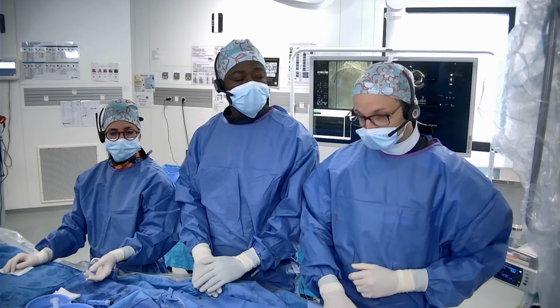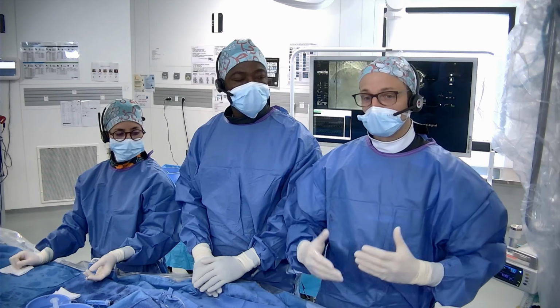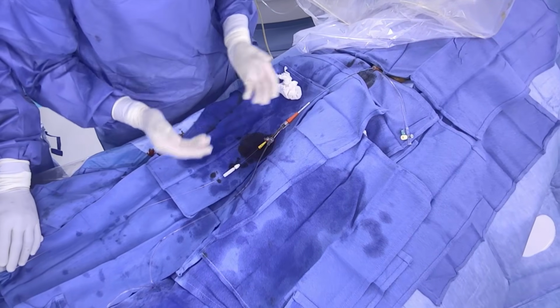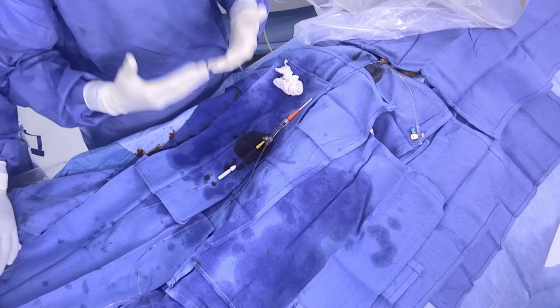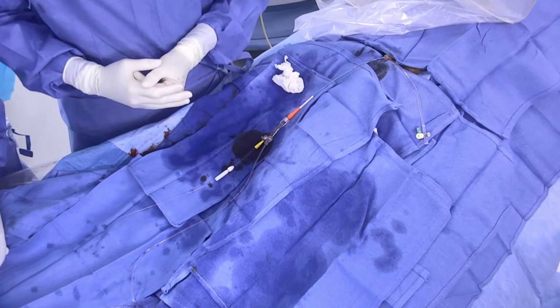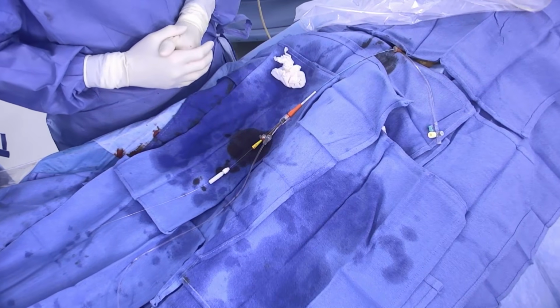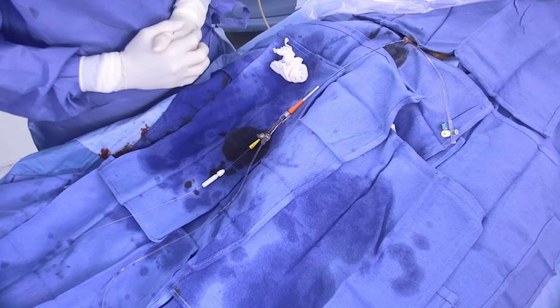So first we will wire with the new RotaDrive guide wire, which is a new wire for rotablation developed by Boston in collaboration with Asahi. It seems that it is a very good wire for frontline wiring and to try to avoid exchange. So we will try to wire the LAD with this RotaWire Drive.